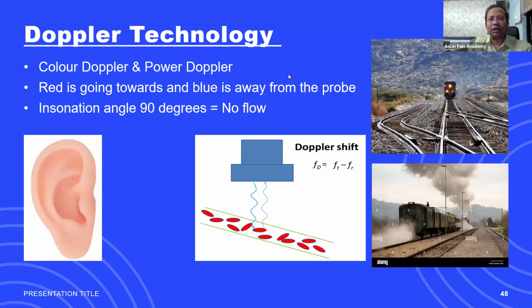Here, an important thing is Doppler technology. Till now, we have compared the ultrasound probe with eyes. Now I am comparing it with ears. So think that this ultrasound probe can hear the returning sound wave. It is not seeing, it is hearing the returning sound.